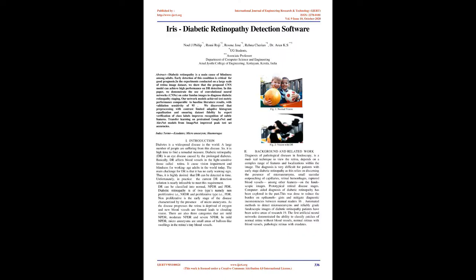Iris Diabetic Retinopathy Detection Software. Abstract: diabetic retinopathy is a main cause of blindness among adults. Early detection of this condition is critical for good prognosis. In the experiments conducted on a large scale of retina image dataset, we show that the proposed CNN model can achieve high performance on DR detection.